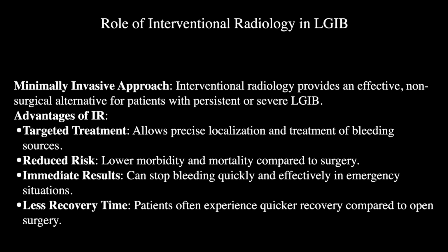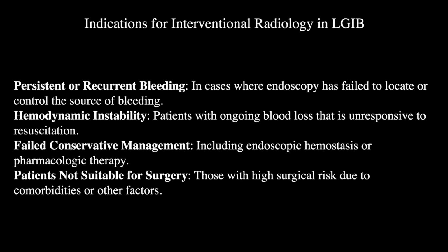Now, what is the role of interventional radiology? So, we provide a minimally invasive approach. There can be targeted treatment where we go to the precise location of the bleed and stop the bleed over there by embolization. It has reduced risk in the form of lower morbidity and mortality compared to mainstream surgery, and you can get an immediate result because you can stop the bleeding quickly, and in fact it has a lesser recovery time also.